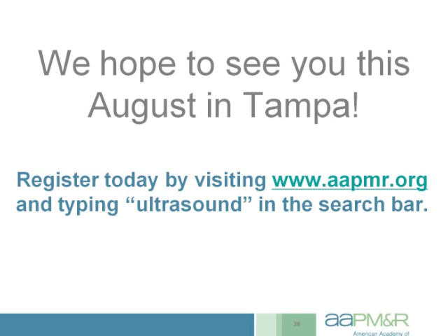One advantage of doing these under ultrasound versus under fluoroscopy, apart from just the greater accuracy in terms of targeting the muscle, is you can usually visualize the sciatic nerve. And as you likely know, sciatic nerve anatomy can be variable. So sometimes it comes out below the muscle, sometimes it's through, sometimes it's over. And in this particular patient, I was able to see that the sciatic nerve was coming out below the muscle. So I actually cheated a bit high in the muscle to intentionally stay away from the nerve so they could drive themselves home, which is, again, a nice advantage to ultrasound.